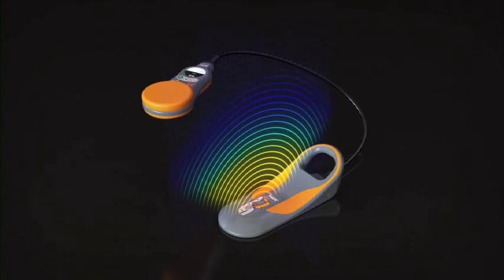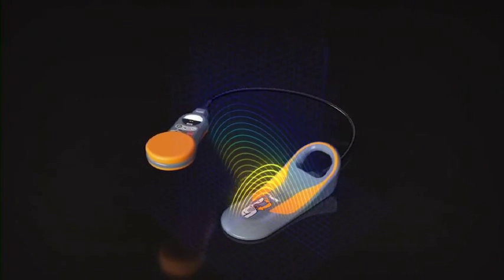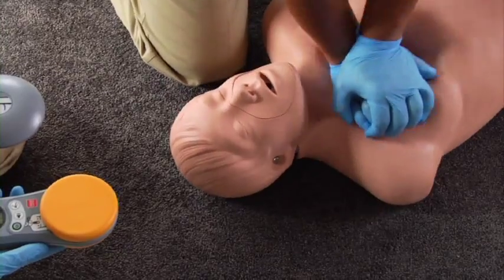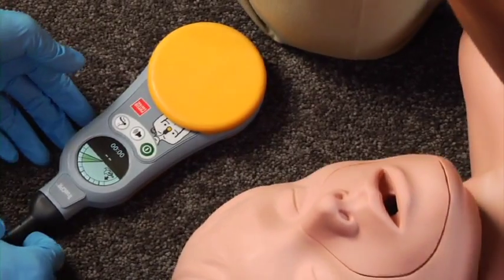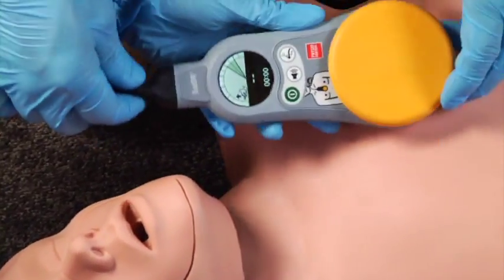TrueCPR calculates the depth of chest compressions by measuring the distance between the chest pad and back pad, so how you position the pads on the patient is important. Bare the chest and dry it if necessary. Put the back pad under the shoulder like this — either side is fine. Place the chest pad so the palm pad is in the middle of the chest on the lower half of the sternum, with the display oriented this way.